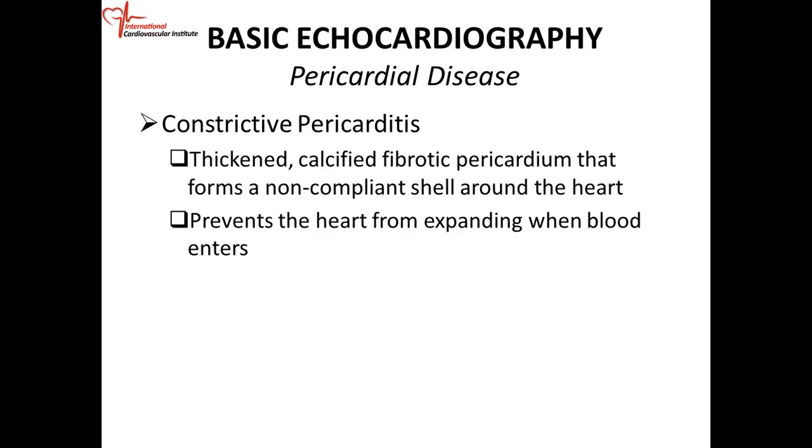All right. So you have to know how to diagnose tamponade, because a patient comes to the echo lab and they have fluid. Your job is to make sure they don't walk out of the lab with tamponade. Okay. So we just went over how to diagnose tamponade.